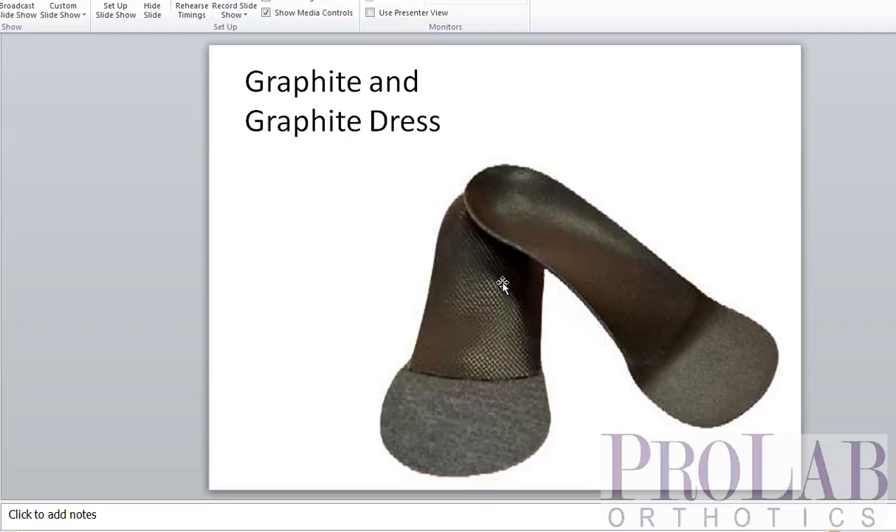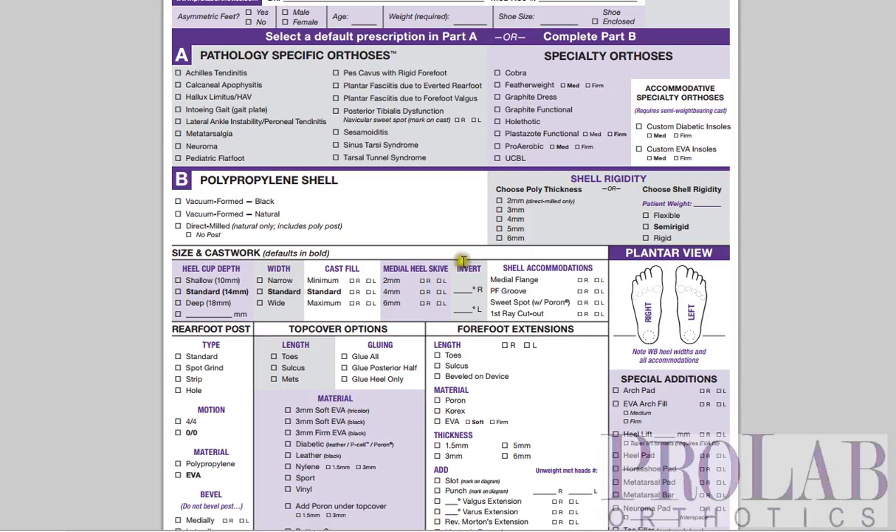It's a nice material and it's quite easy to heat and adjust if necessary. The only difference between the Graphite Functional and Graphite Dress is the size. The Graphite Dress is narrow — meaning it's more narrow from the medial aspect and has a more shallow heel cup — compared to the Graphite Functional, which has a standard heel cup and standard width. In either of these, you can override the defaults by going down to the width section on the form and checking off wide.